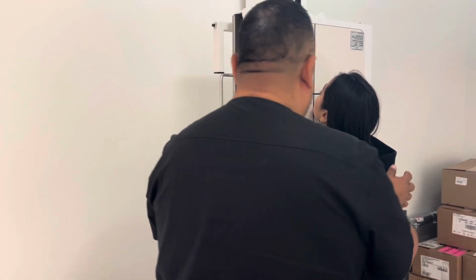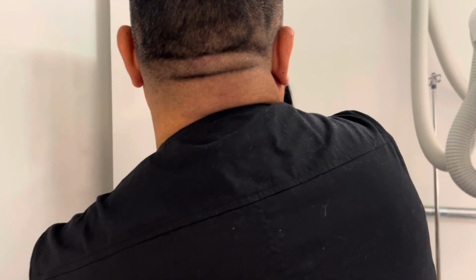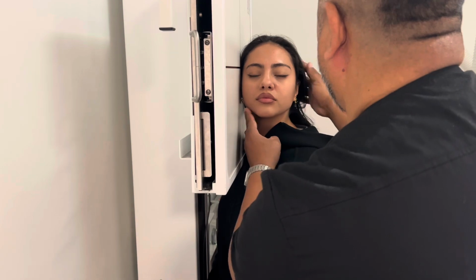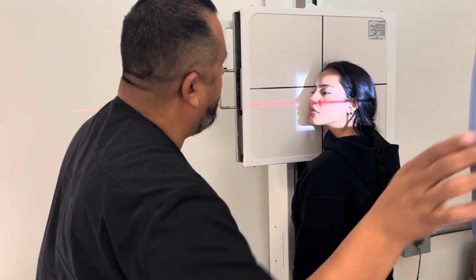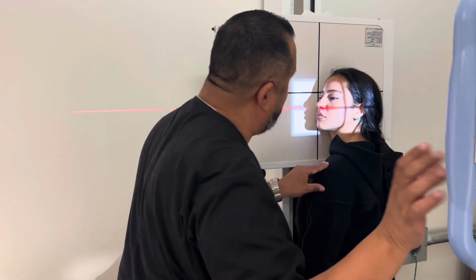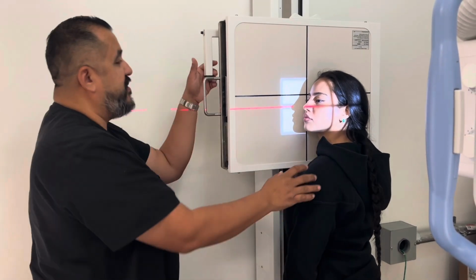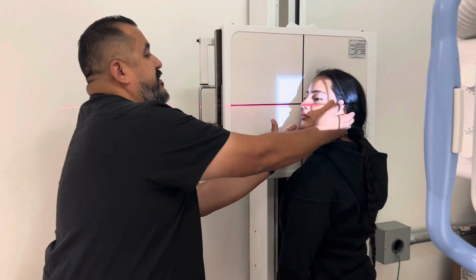All right. So now we're going to do a lateral for the sinus. We're going to turn her body this way. You're going to put your head just like this. Right there. Okay, we're going to turn your body a little bit more so that we can tilt your head down like that. There you go. Right there. Okay. So again, we want to get her mid-sagittal plane parallel. And we're going to put it right on her zygoma. Just like the facial exam, you're going to put it right back on the zygoma. So we're just going to back you up here a little bit. Right there. I'm going to bring this up. Okay. Again, between the outer canthus and the EAM, I'm going to bring this down. I'm just going to watch your face here. Right there. Okay. Just like that.